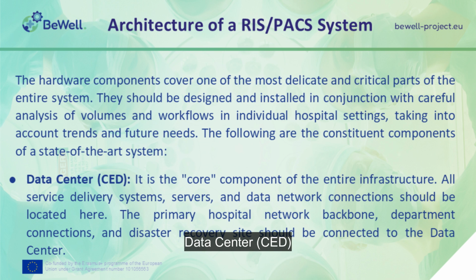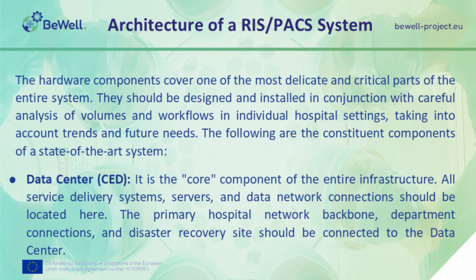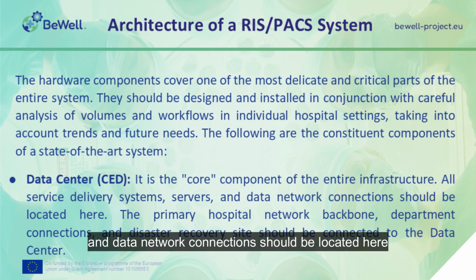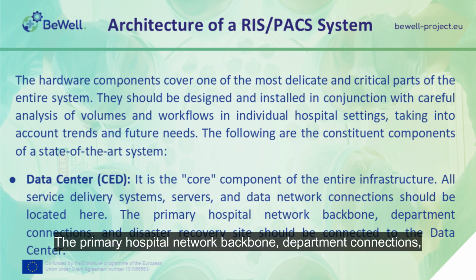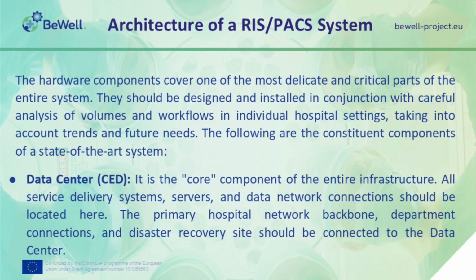Data center. It is the core component of the entire infrastructure. All service delivery systems, servers, and data network connections should be located here. The primary hospital network backbone, department connections, and disaster recovery site should be connected to the data center.